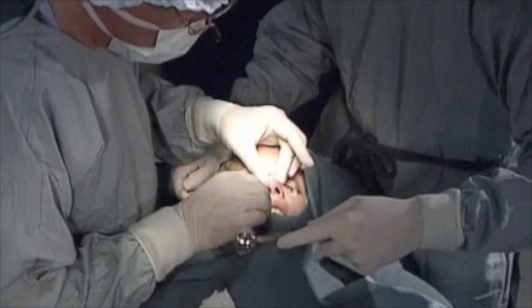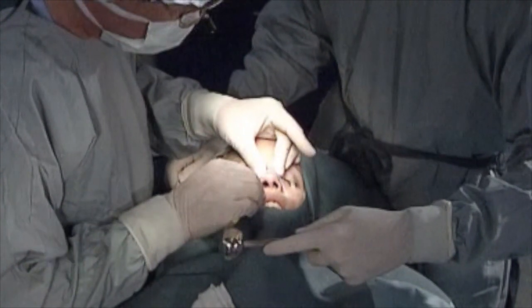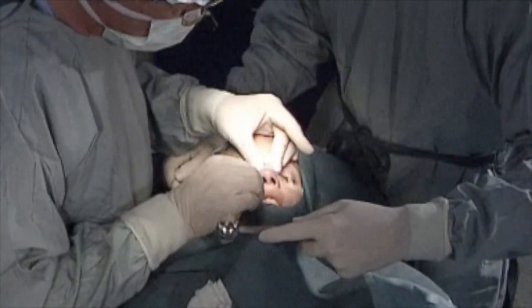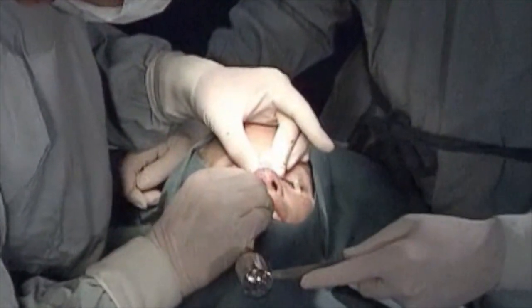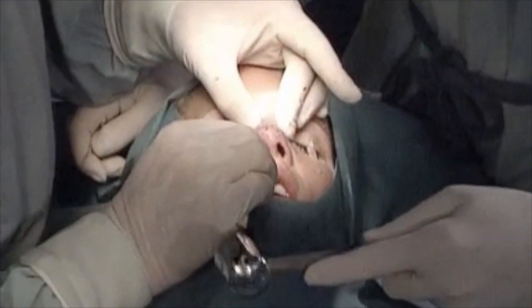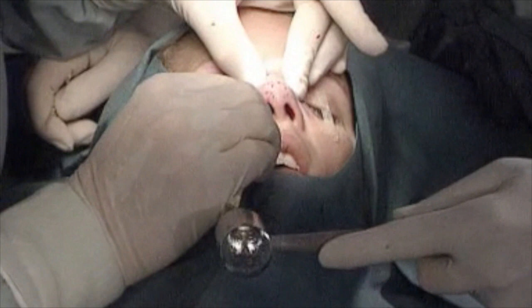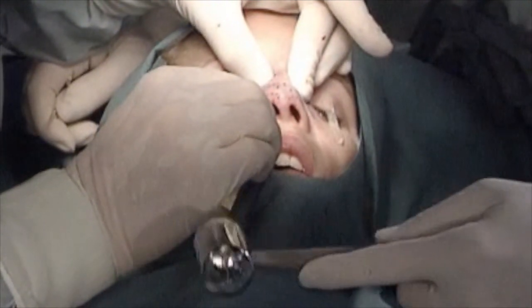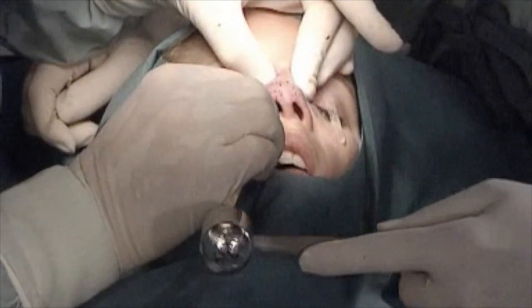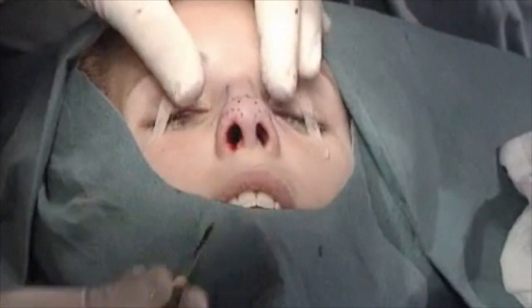Yes. Go on. Strong bone. Quiet. Yeah. Tap tap. Okay, infraction. Perfect.